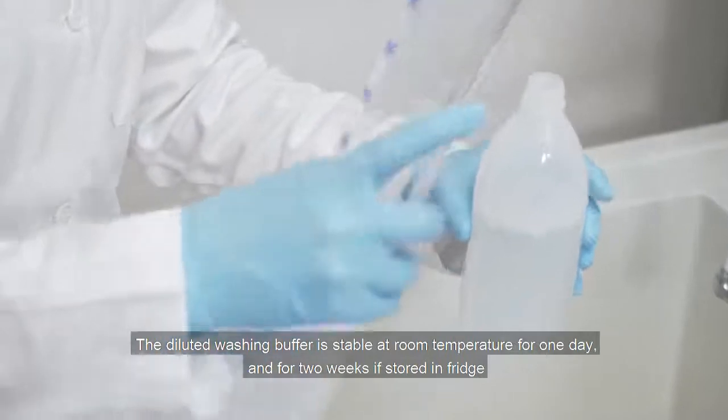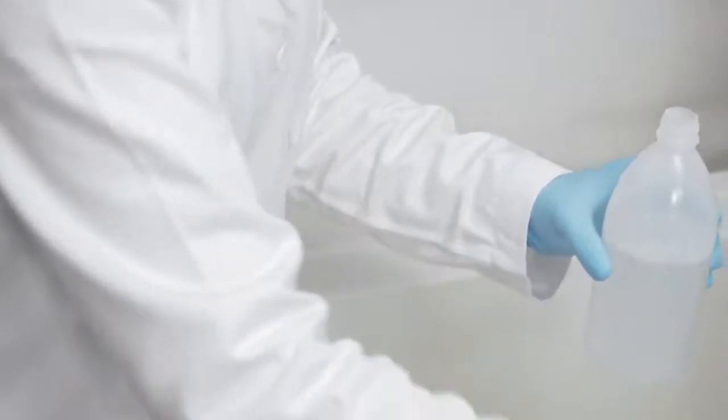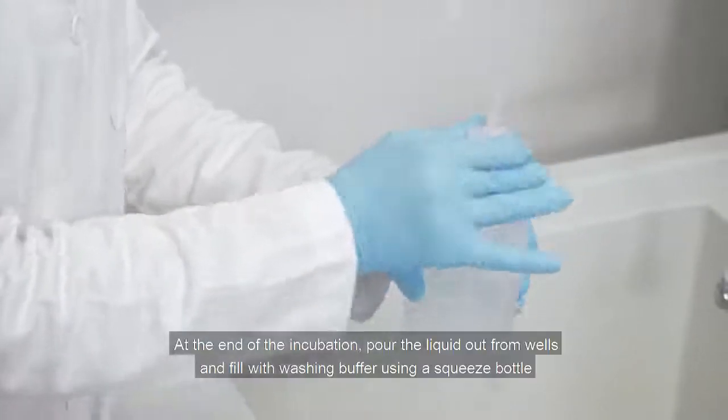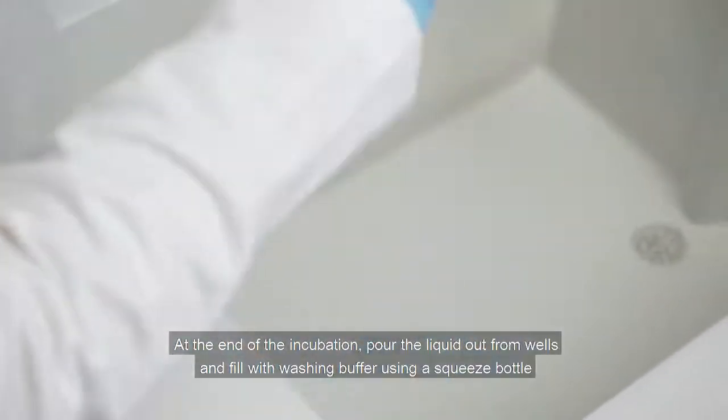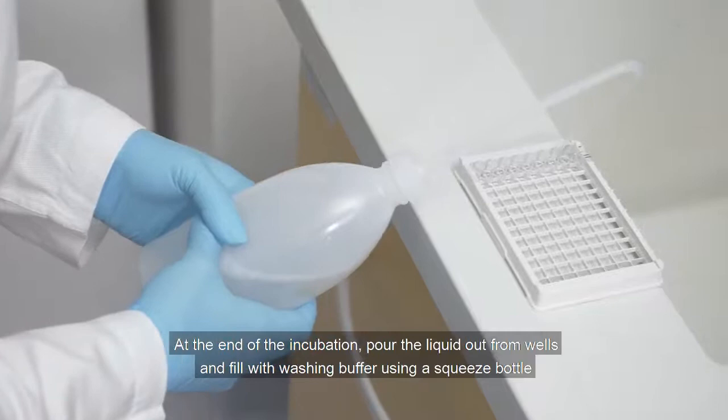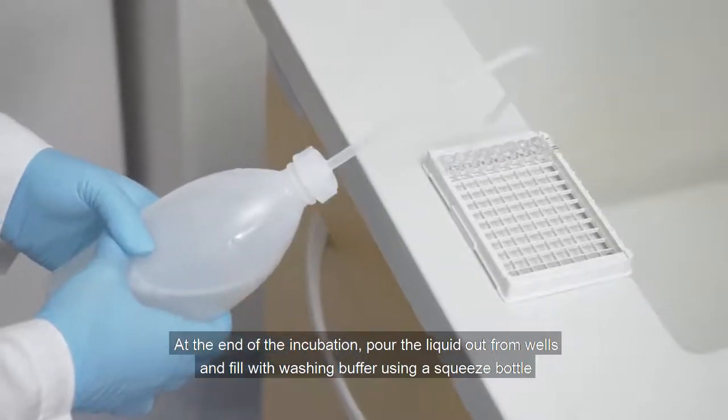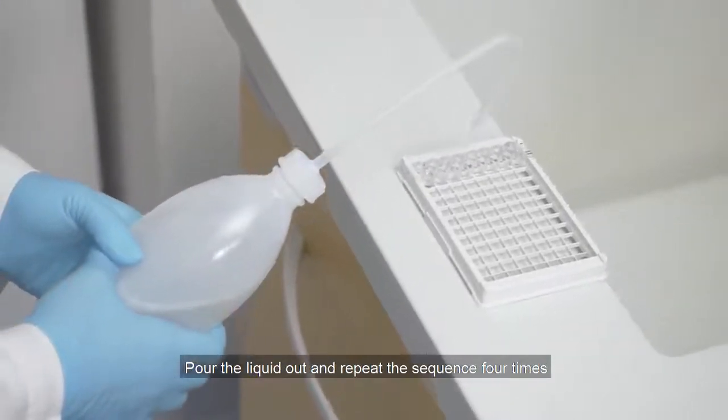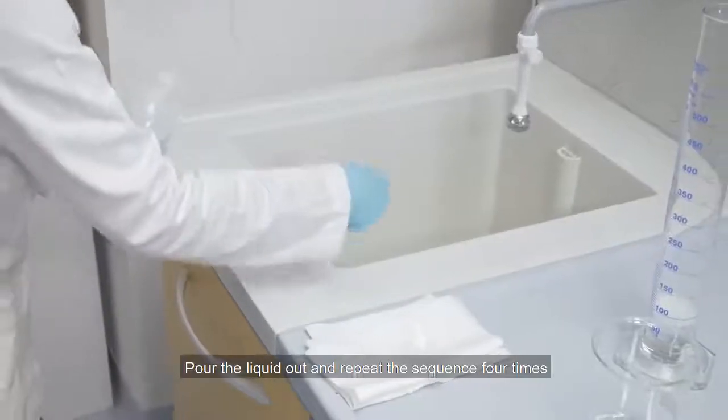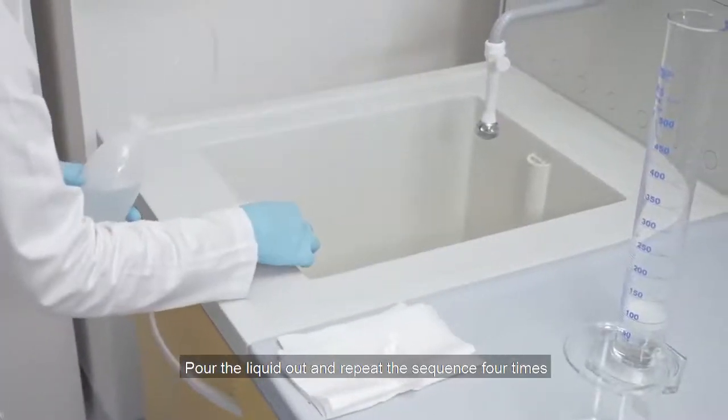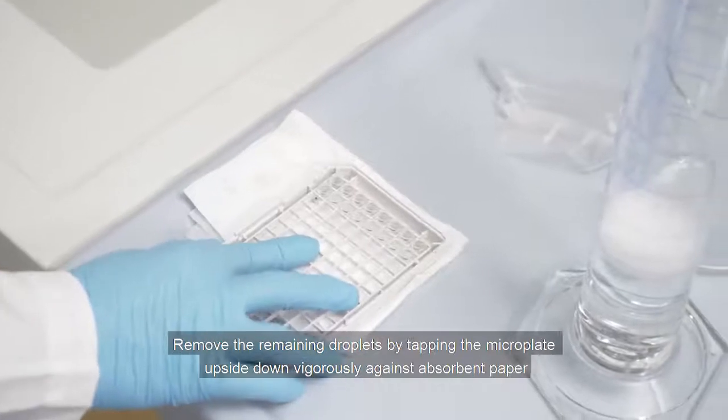At the end of incubation, pour the liquid out from the wells and fill with washing buffer using a squeeze bottle. Pour the liquid out and repeat the sequence four times. Remove the remaining droplets by tapping the microplate upside down vigorously against absorbent paper.